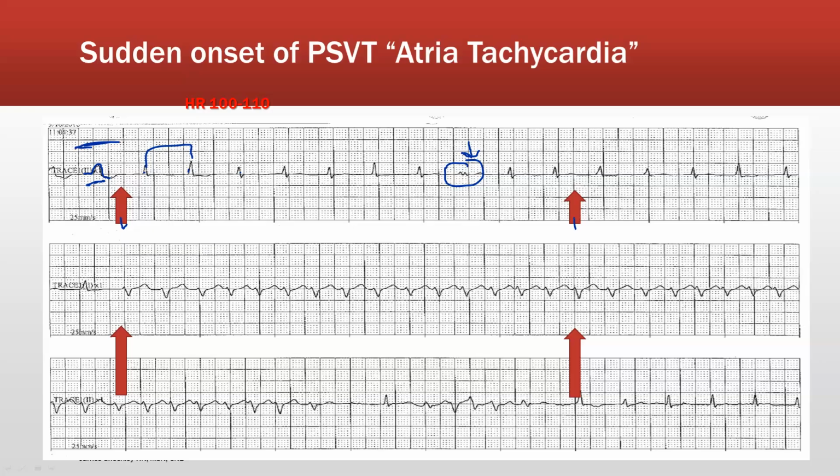Then what happens is suddenly, abruptly, I see this change in my heart rate. No, you don't see a whole lot of change in the size of the QRS. Notice what we do see is that it kind of flips the other way.